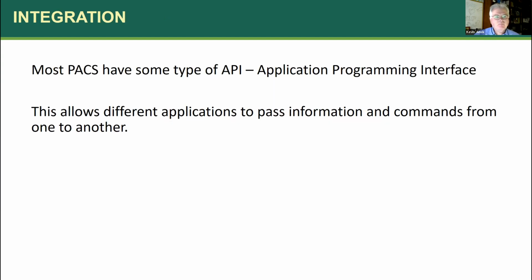Okay. So integration, most PACS have some type of API, application programmer interface. This allows different applications to pass information and commands back and forth from one to the other. We're already familiar with that. For the most part, the PACS is tied into the voice recognition system.